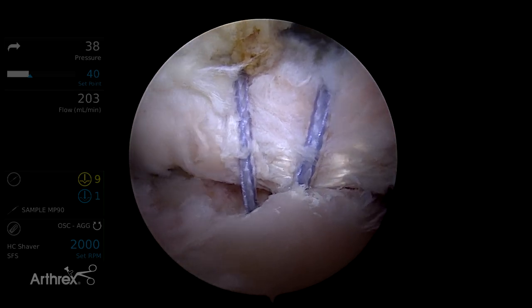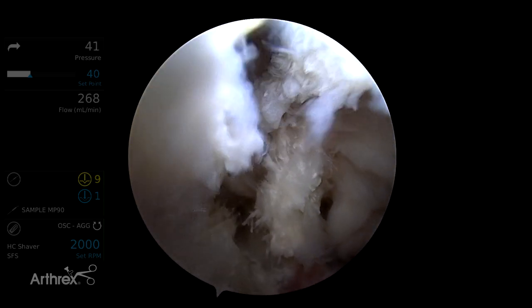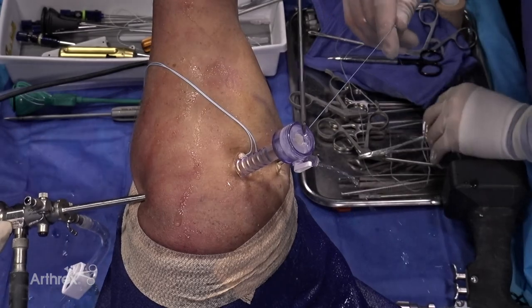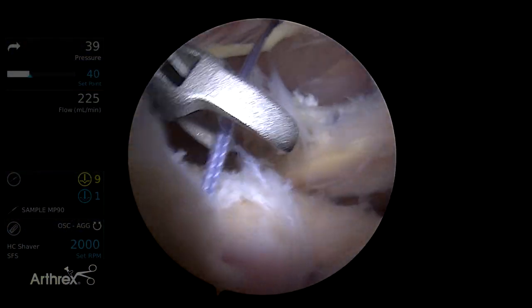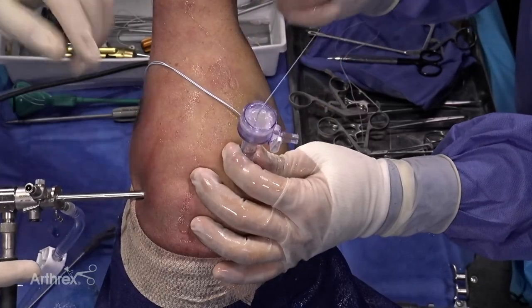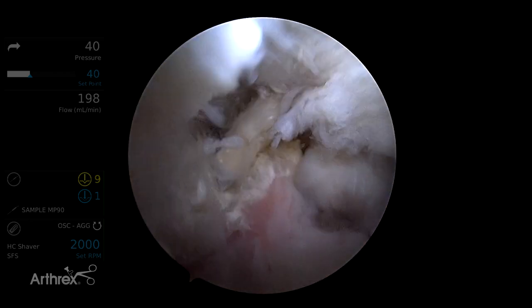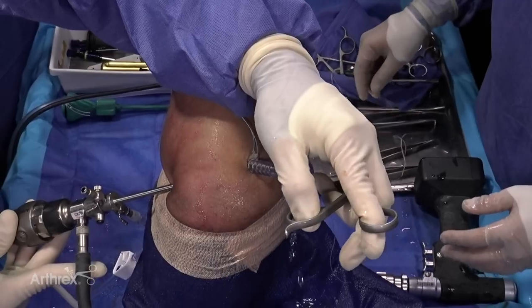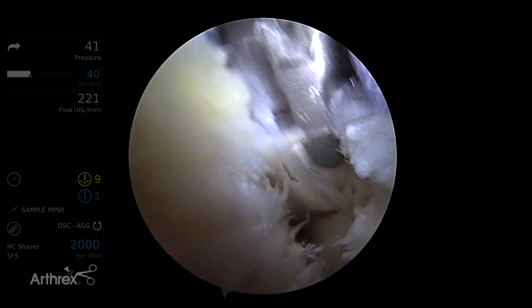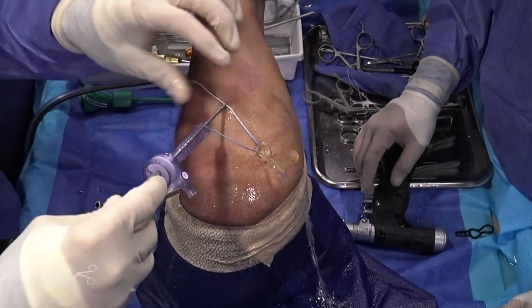My medial row is complete. I'm going to preserve this lateral limb because I'm going to incorporate it into my biceps tenodesis. Now I need to retrieve those sutures — take the snap off the biceps tendon and retrieve them. I'll retrieve my repair stitch first, looking around the comma tissue and taking that suture out the ASL portal. This will really help close laterally when I bring the tenodesis down. Now I'll get the bicep sutures — typically you can retrieve through the portal cannula, but if they're hung up, you can put the retriever through the cannula to go and get the bicep sutures.